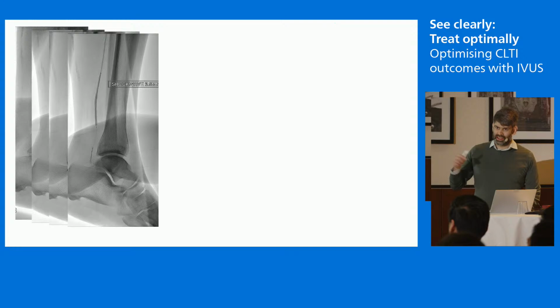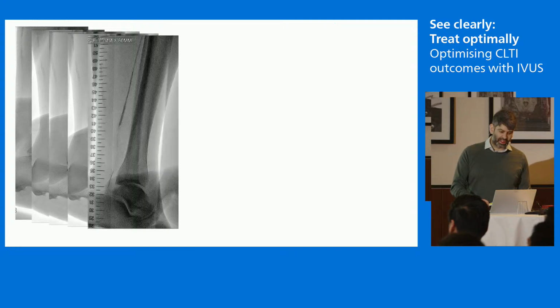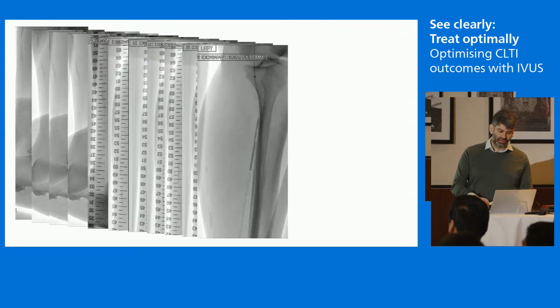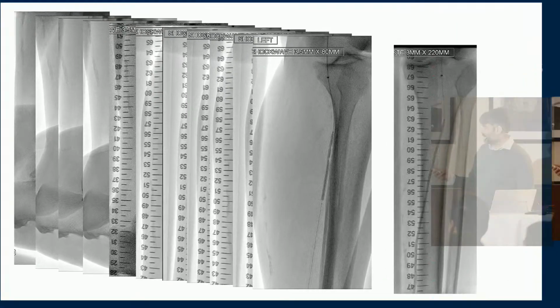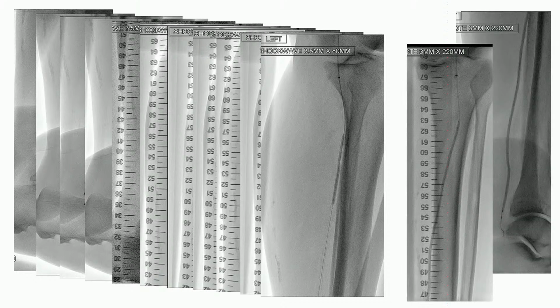So you want to get it while it's still nicely wrapped as distal as possible, and then work your way back. That's what we did here, all the way up the posterior tibial artery to the origin. Then, because we've decided from the pre-IVUS that the size is 3 millimeters, we've gone with a 3 millimeter plain balloon angioplasty all the way down the PT.